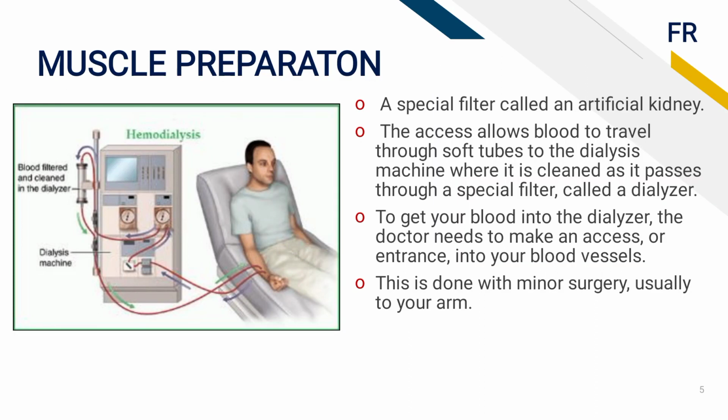The blood enters into the hemodialysis machine, and the machine purifies your blood. In the sense, it removes everything that needs to be purified from the blood as your kidney does. This machine also does the exact same thing by some process.